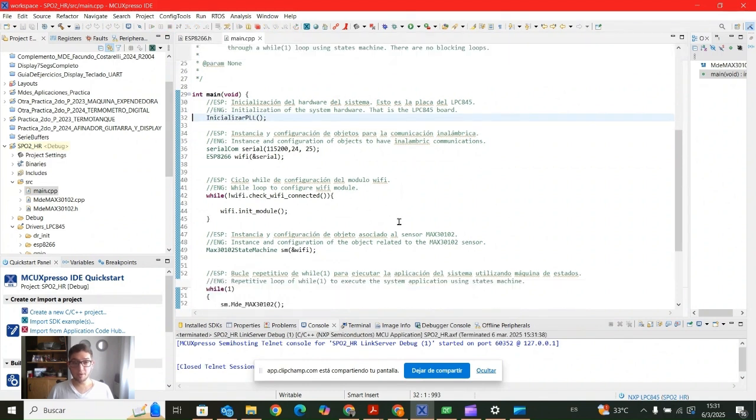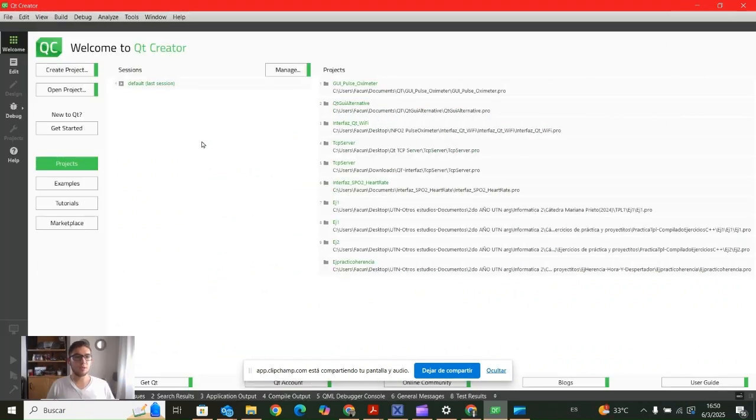It's important to remember that at this moment we only need the microcontroller. We don't need any kind of source, we don't need any kind of battery, only the LPC connected to the computer via a USB to mini USB wire. Now, after doing the proper setups in the code, as I mentioned before, and making all the preparations, at this moment, I'm going to present the project itself, what it is expected to be done with this project, and the capabilities and everything that can be done with it.